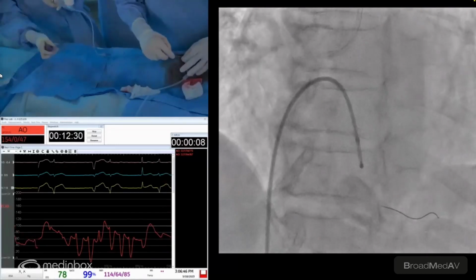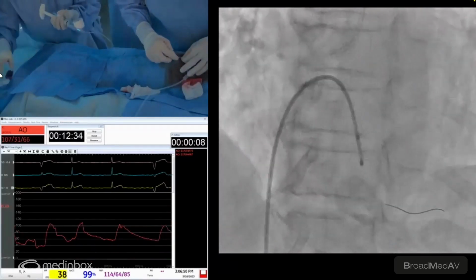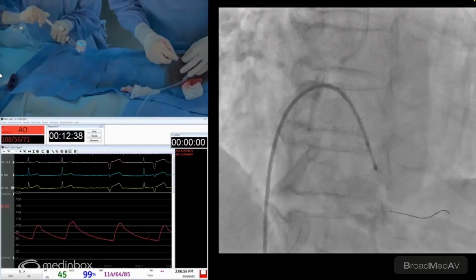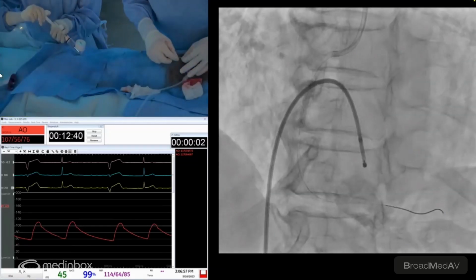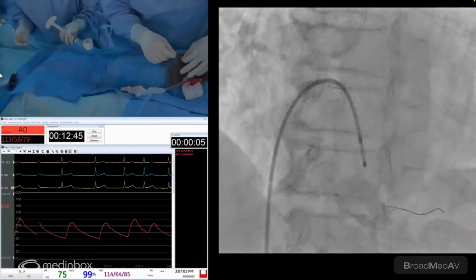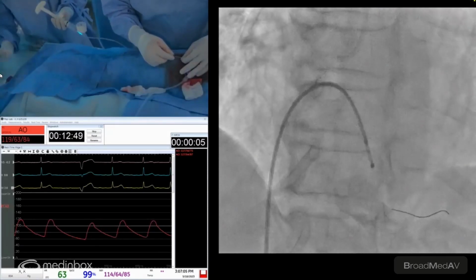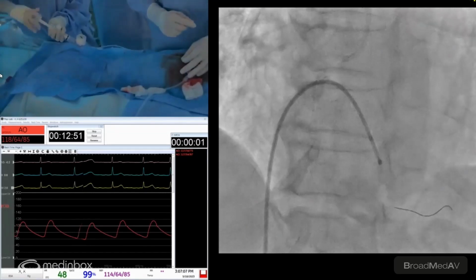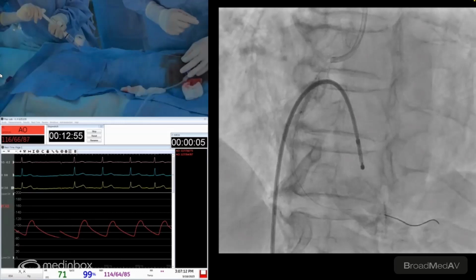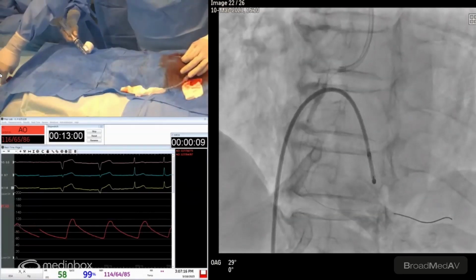Well, go back to where it ruptured. It was at the beginning, the proximal lesion. Okay, go to 18. 18. Okay, off. Good expansion on the balloon. Go to 18. So we have quite good expansion of the balloon. Off, and check fluoro.